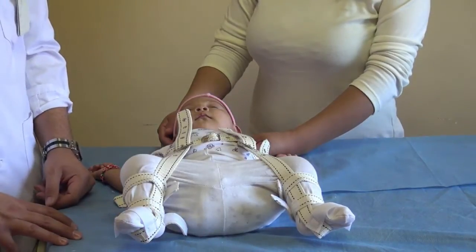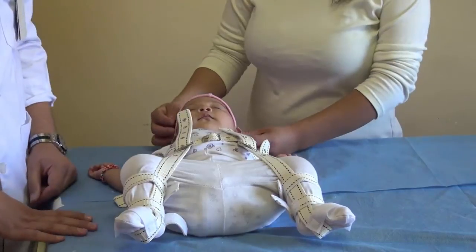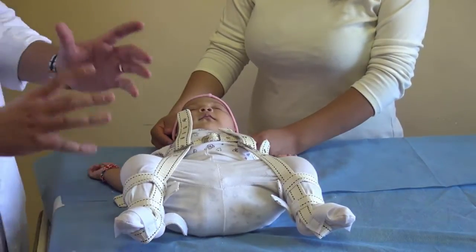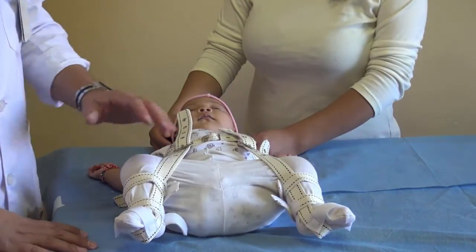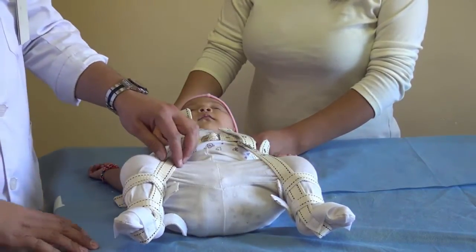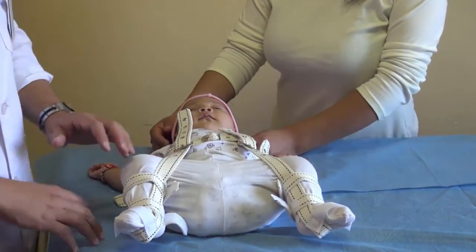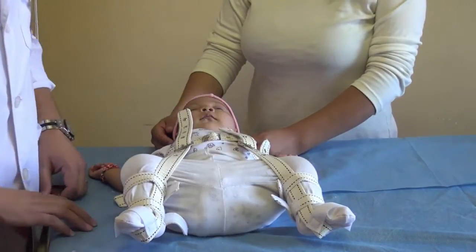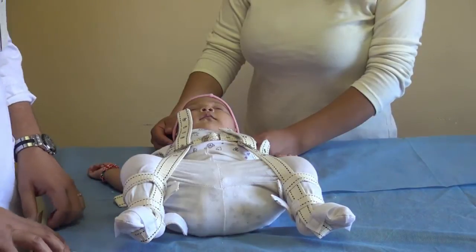We're going to talk about some tips we always tell the parents when they have to use this Pavlik harness. The first tip is that they always must wear clothes under the harness, because the harness might do some damage to their sensitive skin — in the lower legs, up in the arms, or in the thorax. So they always have to use clothes.